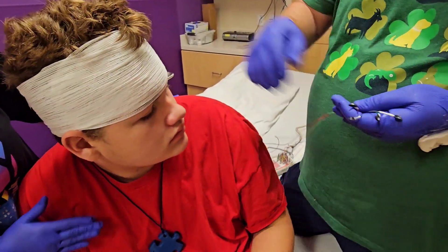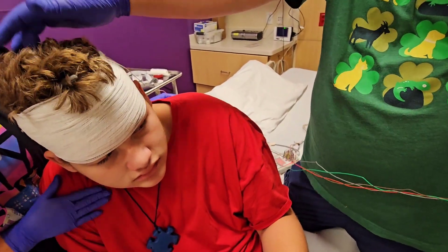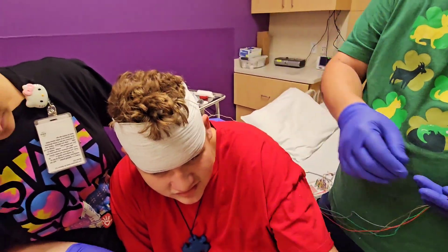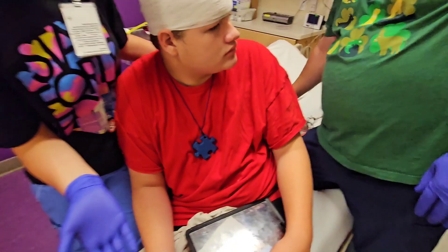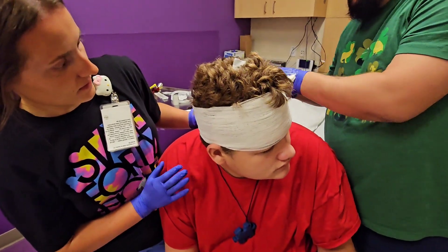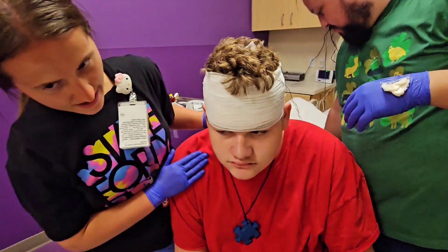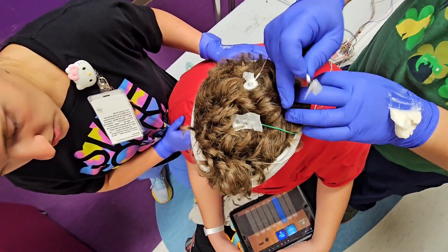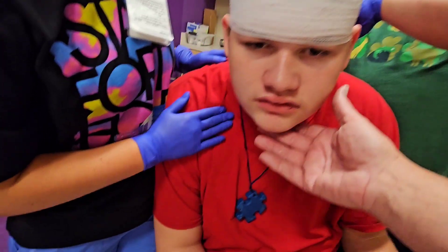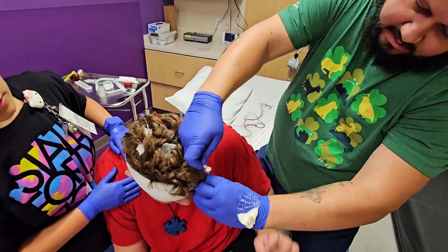Different colors — see the different colors? We're gonna put different colors, it's okay. Look, look, look, nothing's in my hand. Right here, see, we're gonna put them right here. Like that, see — that's where they're gonna go. It's weird right? See, that's how it feels, that's all. One, two, three — there we go, ready, good job buddy. One, two, three! Ready, one, two, three! One, two, three! You are so so good buddy, you're doing great. Alright, this one's gonna go right here — you ready? One, two, three — yay! Good job, you did it, there's no hurting!